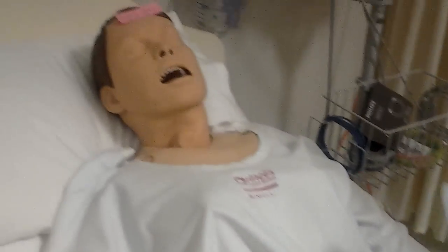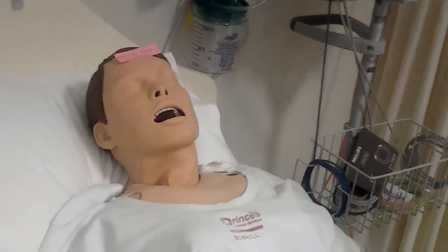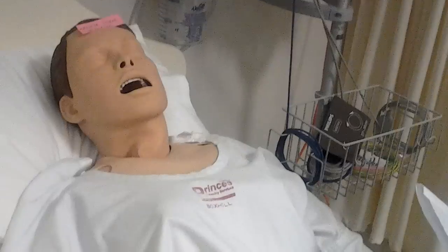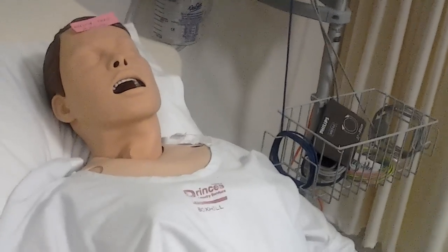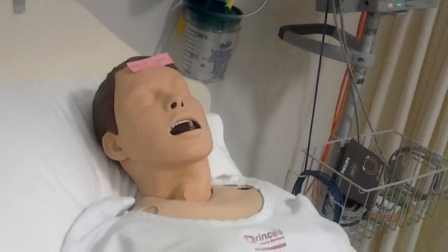Explain the procedure to the patient. Thorne, I'm going to give you the metoclopramide injection for your nausea. I hope that's all right. That's fine. All right, I'm going to place the injection into your left thigh. Is that all right? Yes, thank you. All right. Locate the injection site and assess for signs of scarring, burns or infection.